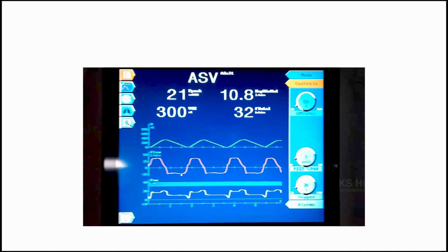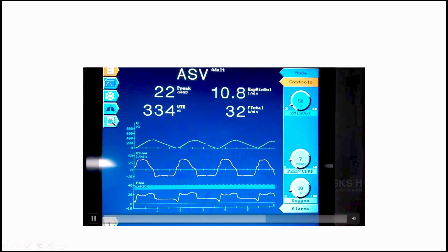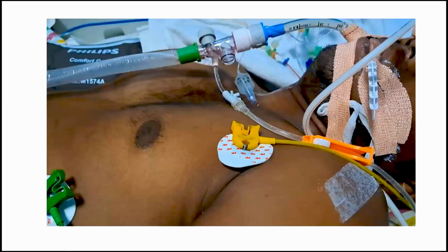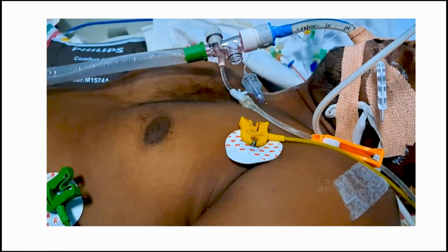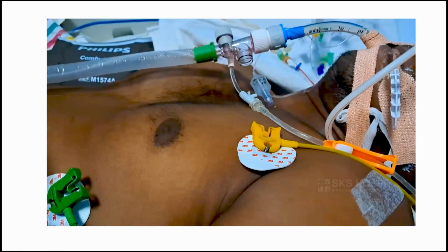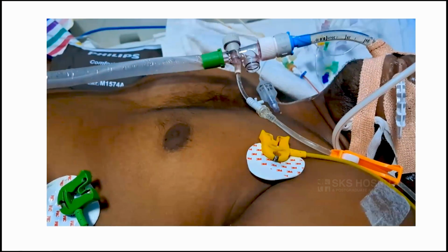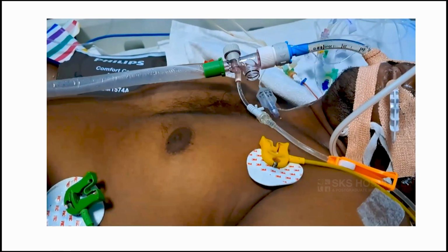This is actually a patient who has an endotracheal tube which is blocked. In this situation also, he may not be able to trigger effectively. And so if you disconnect the patient from the ventilator, this is what you see. You get a paradoxical breathing. So you can see the paradoxical breathing. You never will be able to wean this patient. We actually exchanged the tube for a new tube, and that sorted out the problem. So this actually can lead to trigger dyssynchronies also.